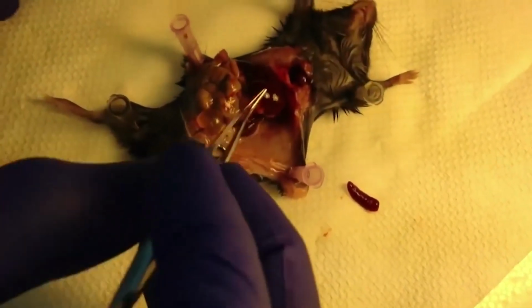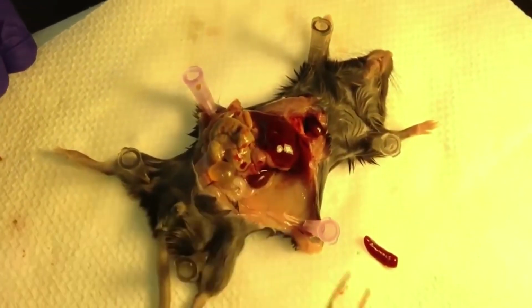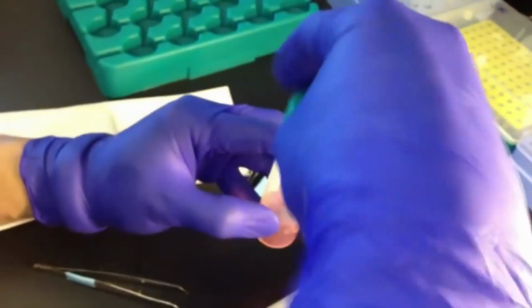Okay, and so now you can still see the kidneys here and the liver here, and so the spleen was right here. And now all you have to do is take that, put it into a 50 ml conical full of media. So this is complete media, and just drop it in. And that's it.